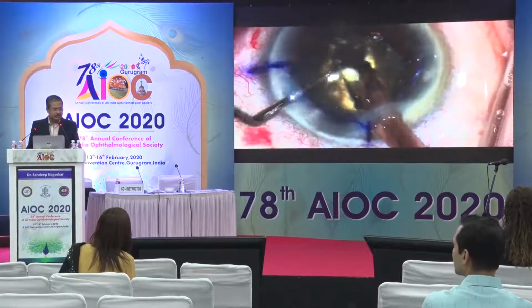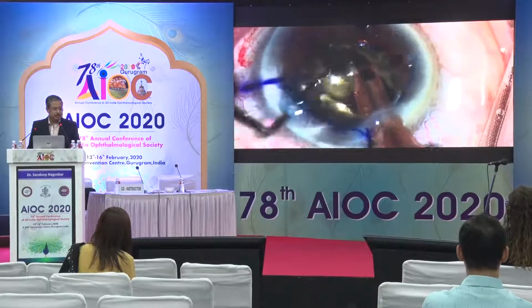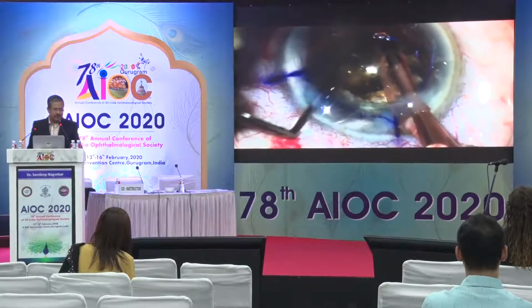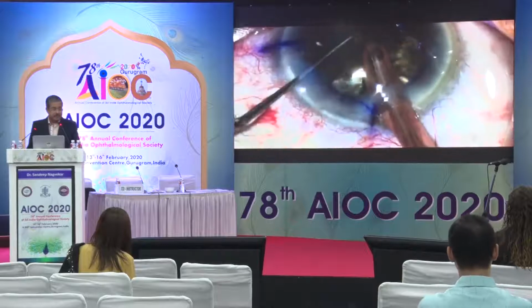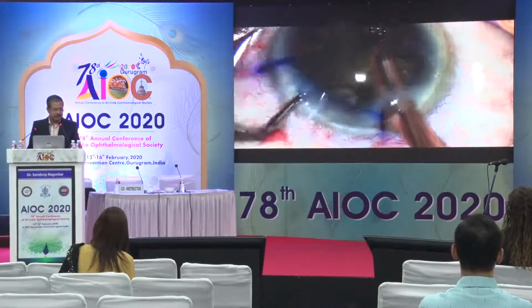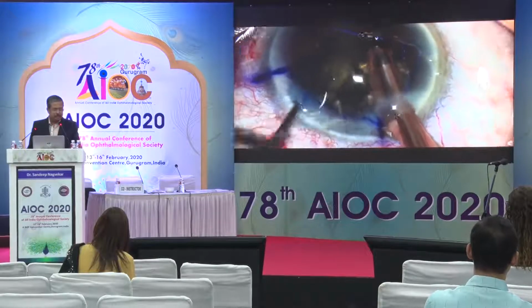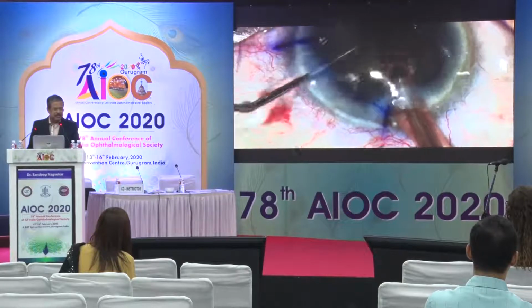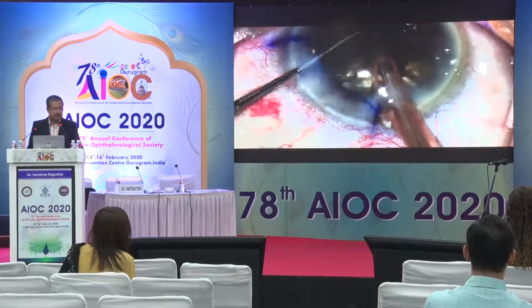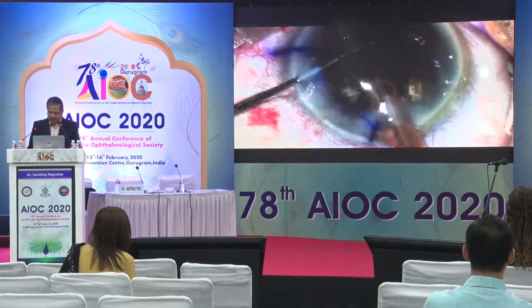But in this case, the only thing that was very stressful was a 90-year-old, one-eyed patient. He had lost his first eye due to vitreous loss and retinal detachments in the previous eye, and hesitated about doing the second eye till his son, who was a radiologist, literally forced his dad to come on the table. So we had a very anxious patient who had been given a little sedation, but we somehow managed to do the case. As you can see, we had even planned for a toric lens, and I'm happy to say that this person enjoys 6/6 unaided vision today.